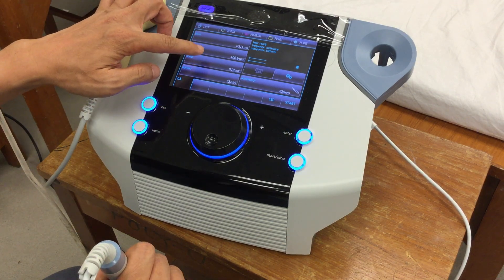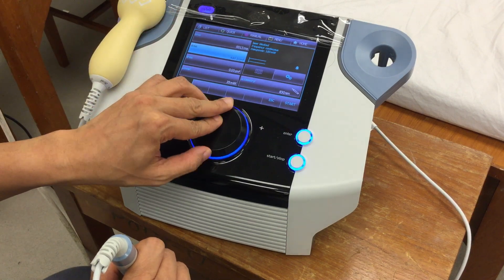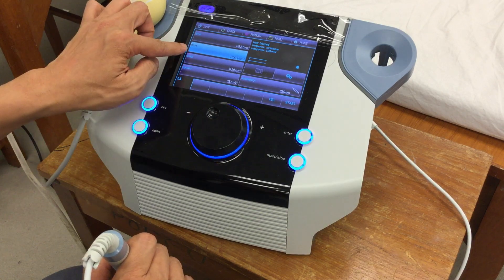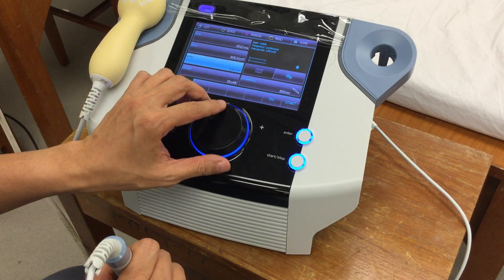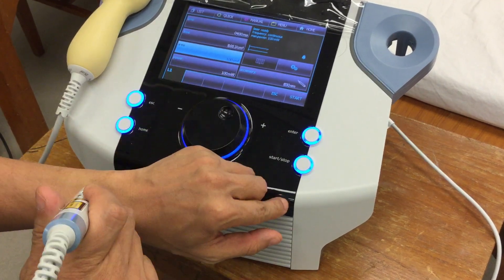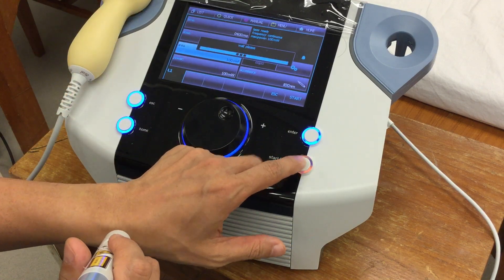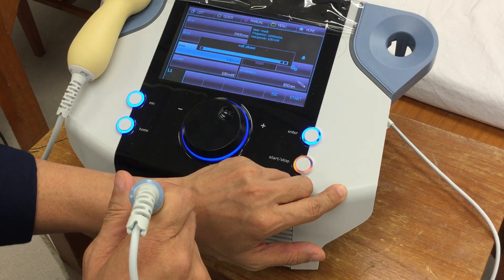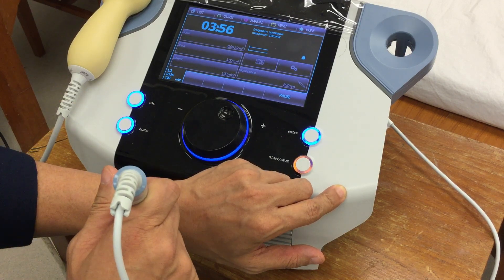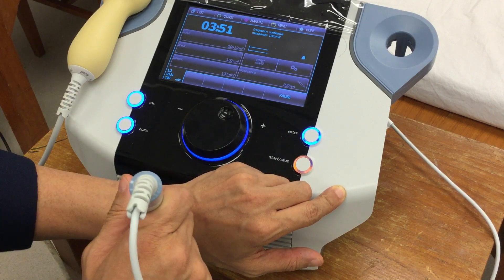If you want to change the area — for example, a bigger treatment area — you can change the dosage to 8 joule per cm² and set your area to 3 cm². Then press start. If this is the painful site, just move the probe along it covering 3 cm², for around 4 minutes.